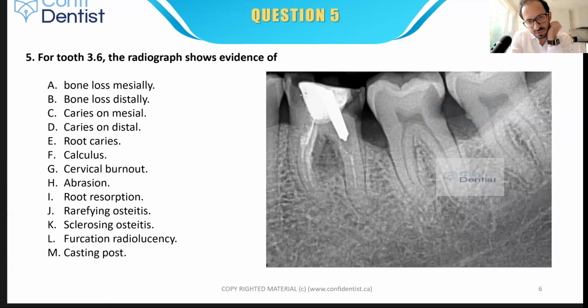Explain the bone loss on the mesial. So guys, this is my CEJ. This is the bone level. This is more than 3 millimeters, okay? So we discussed the concept in our comprehensive ACJ course, that we look at the size of this triangle. If the size is getting bigger than normal, that is a sign of periodontal bone loss, okay? And it is getting larger than what is supposed to be. So the triangle approach is the easiest way to select cases that you're in doubt about when it comes to periodontal bone loss, especially when cases are borderline.